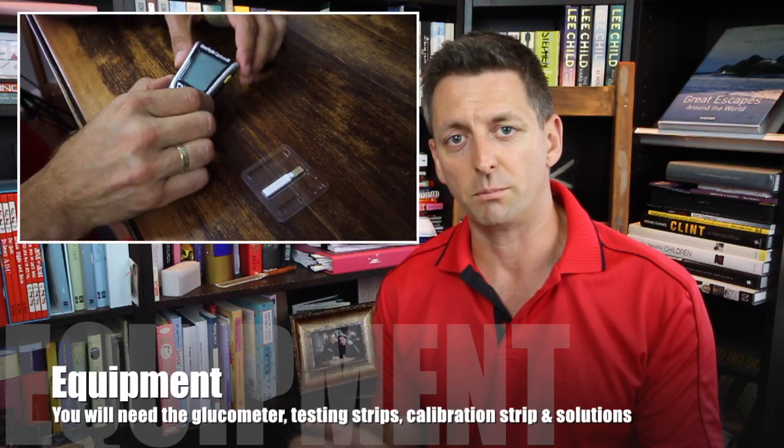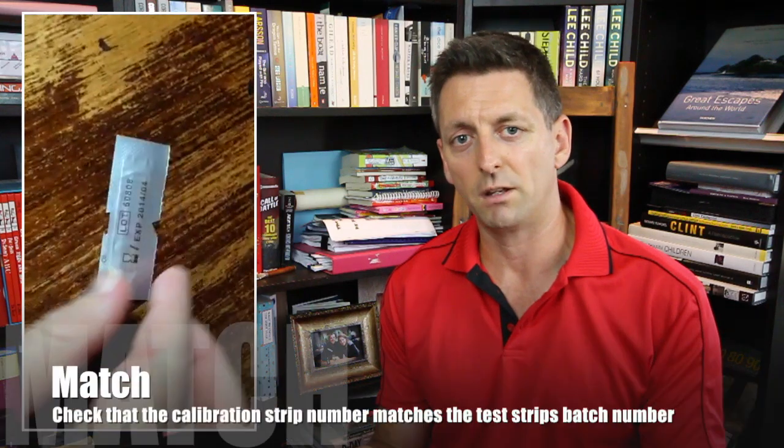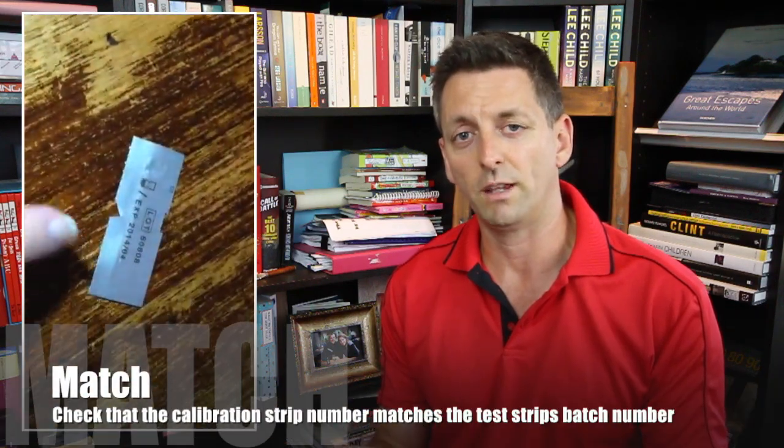Firstly, we need to get the actual glucometer — there's a special test strip that comes in each box. Depending on the brand of glucometer you use, you have to look for the manufacturer's instructions on how to calibrate it. But for the little Avid one I have today, all we have to do is hold the glucometer in one hand, gently pull out the test strip without touching the silver bit at the bottom, because if you do that you can affect the reading. Check that the lot number matches the box that it came out of, because those are the test strips you'll be using. And if all that matches, all you have to do is plug it into the bottom of the glucometer.